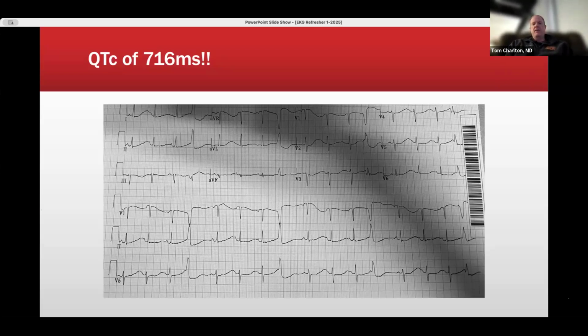But this case right here is why you have to get a 12-lead EKG on everybody who is lightheaded, dizzy. I think I might pass out. My friend might pass out, you know, et cetera, because you're gonna catch one of these at some point. If we had gone, you know, she had called 911 and we had gone, unfortunately, some of us would have just let her refuse if she wanted without doing an EKG.